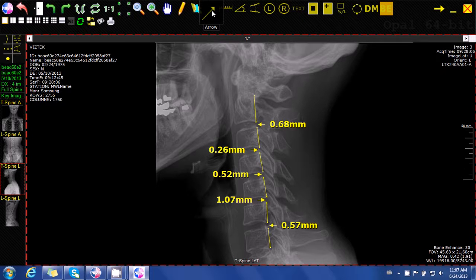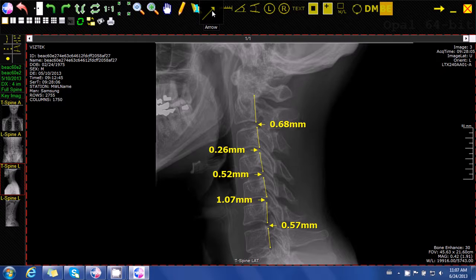The software will then display the amount of misalignment that each vertebra has in relation to the vertebra below it. The arrow associated with each vertebra shows us the direction of misalignment and the amount of misalignment in millimeters.